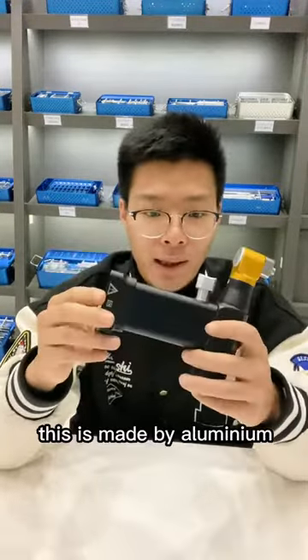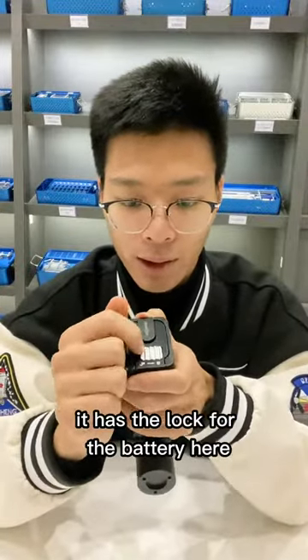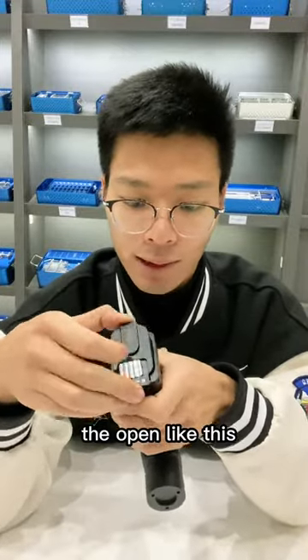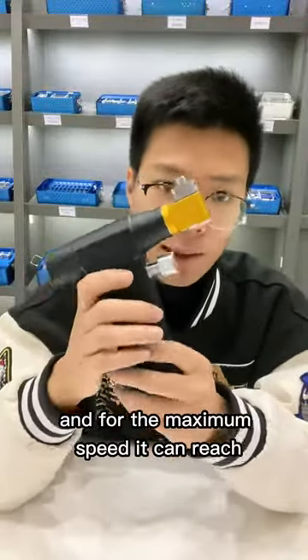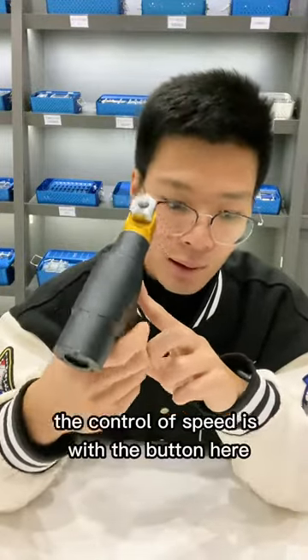This is made of aluminum, and like our other power tools it has a lock for the battery here — you can open it like this. The maximum speed can reach 14,000 times per minute.